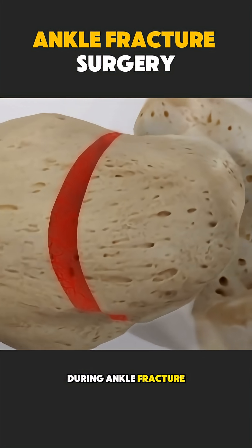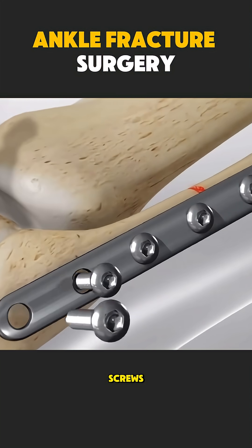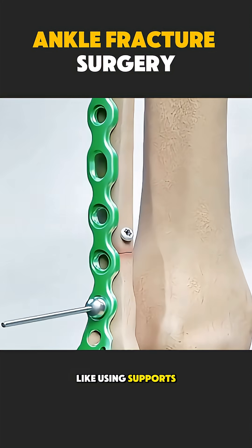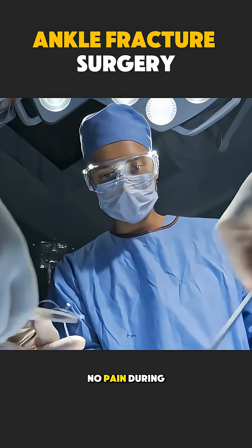During ankle fracture surgery, the doctor gently puts the broken bones back into their correct position. Small metal plates, screws, or rods are used to hold the bones steady, like using supports while concrete dries. The patient is given anesthesia, so there is no pain during the surgery.